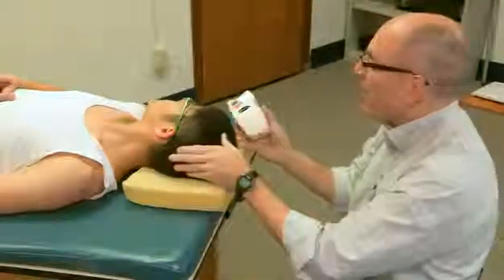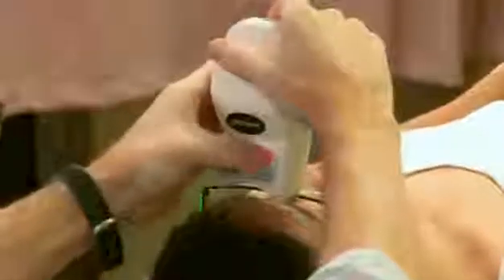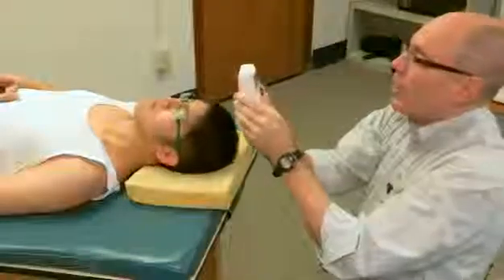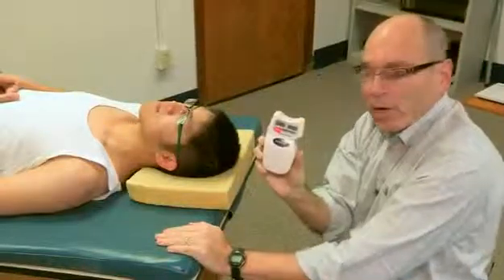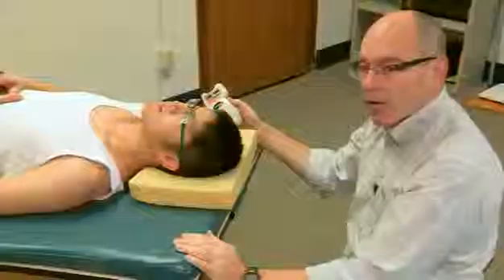I can now repeat this but have him go to the left. We start in a neutral position again. I put it right here and set it. Now turn your head to the left. I set it again, hit the red button one more time, and end up with 43 degrees. So he had 43 degrees of neck rotation to the left.